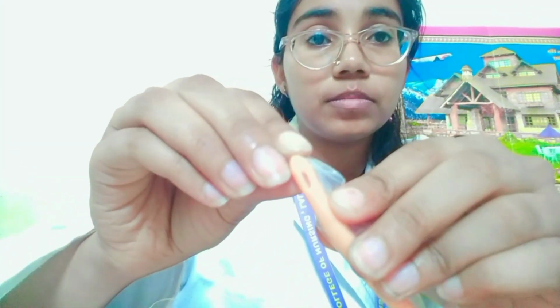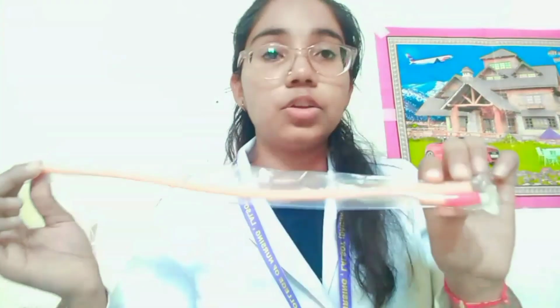I will tell you the parts of the urinary catheter also. From the proximal end, you see here the tip of the catheter which is inserted into the urinary bladder through the urethra. And you see here a small opening, a small hole. It is called the drainage eye, which allows urine into the catheter tube. Below the tip of the catheter, a part called the balloon is inflated to secure the catheter in place within the urinary bladder. A thin, long, flexible rubber tube allows urine to flow to the urinary drainage bag. From the terminal end, there are two lumens, a large lumen and a small lumen. The large lumen is used to drain the urine from the bladder, and the small lumen is used to inflate the balloon. Okay, now let's start the procedure.